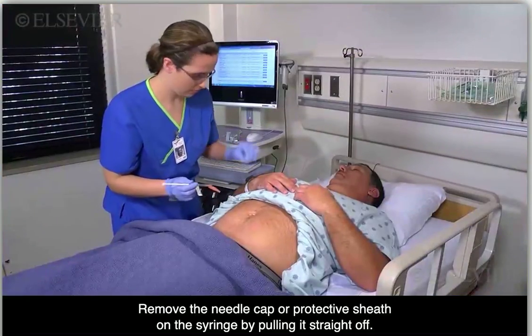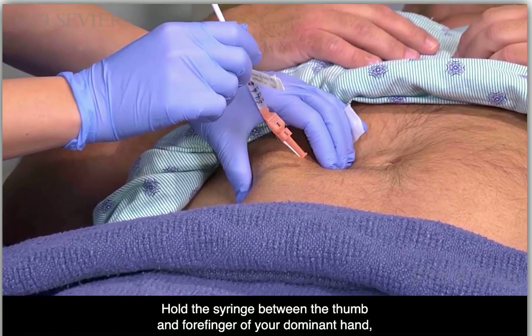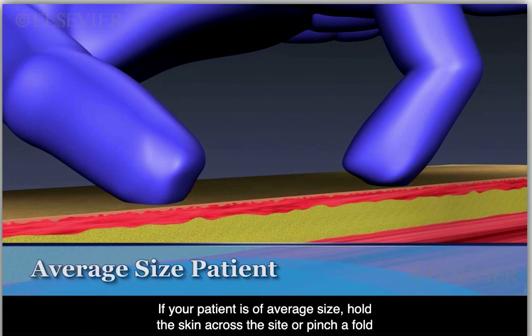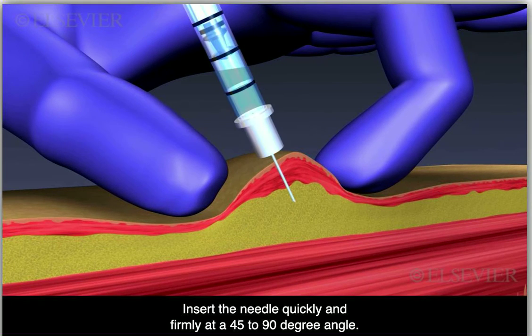Remove the needle cap or protective sheath on the syringe by pulling it straight off. Hold the syringe between the thumb and forefinger of your dominant hand as though you were holding a dart. If your patient is of average size, hold the skin across the site or pinch a fold of skin with your non-dominant hand. Insert the needle quickly and firmly at a 45 to 90 degree angle.